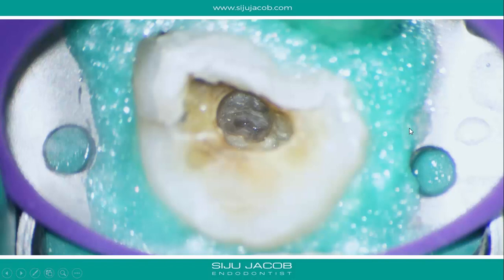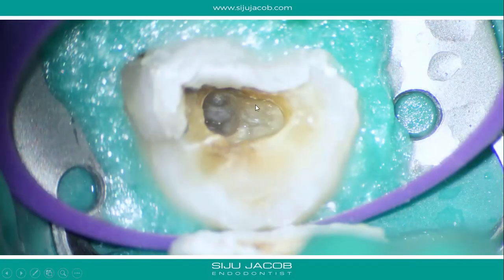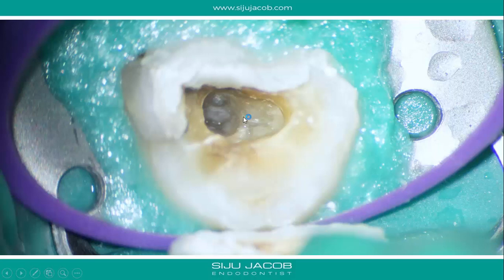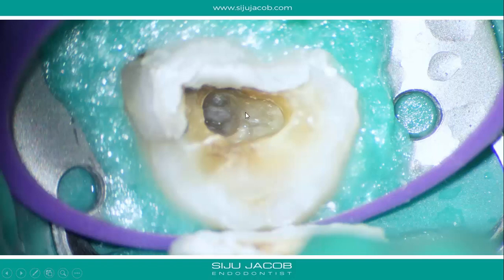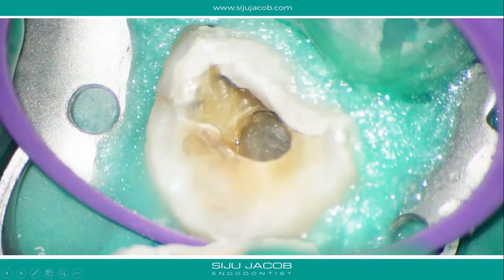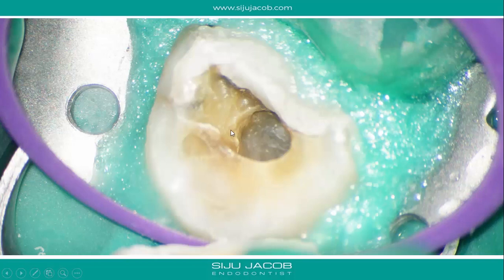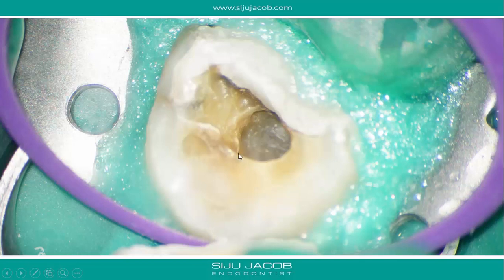We first evaluated the cavity the previous dentist had made and assessed the remaining tooth structure. Looking palatally, there seemed to be some calcified tissue, but quite a lot of tooth structure between that and the external palatal surface — so drilling around that area looked safe. On the buccal aspect it was less conclusive; the tooth structure was slightly less than the palatal side and I wasn't sure whether it was safe to drill there.